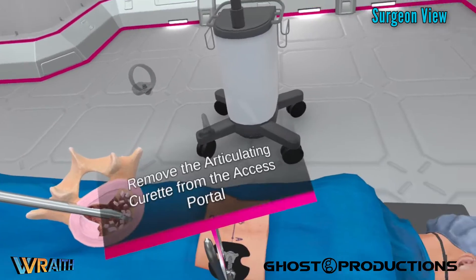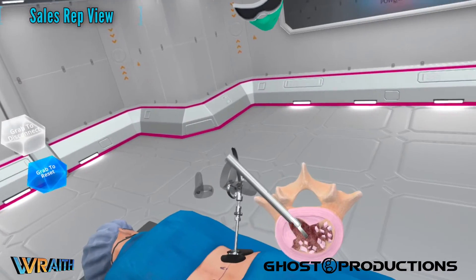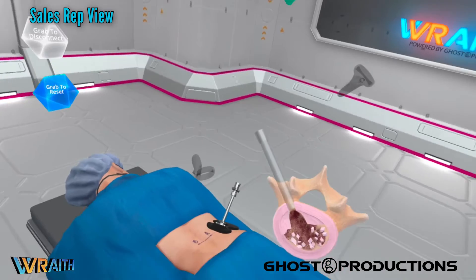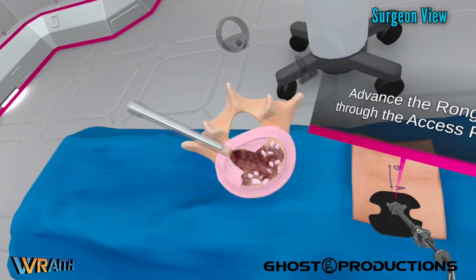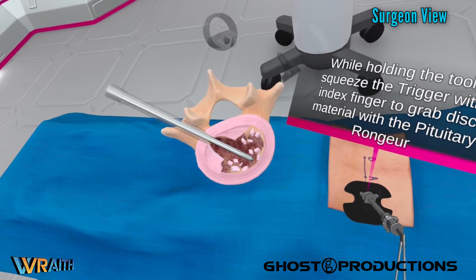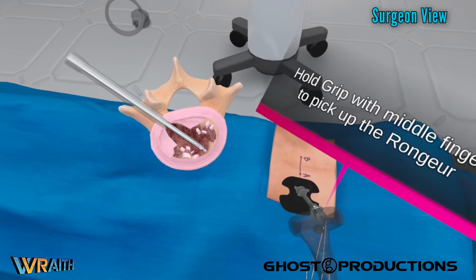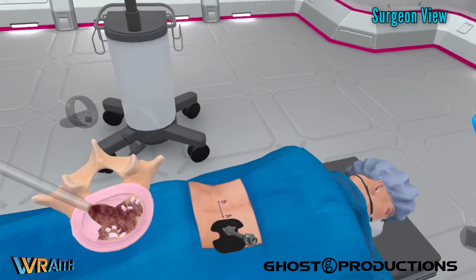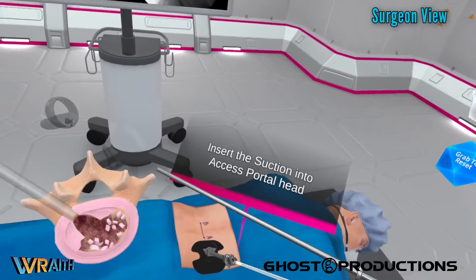I scraped this off both end plates by just rotating it slightly? It's defaulted to an open position so it doesn't get stuck in the access portal. You can use this as often as you need to clear out disc material that's been loosened up by the shaper and the drill.